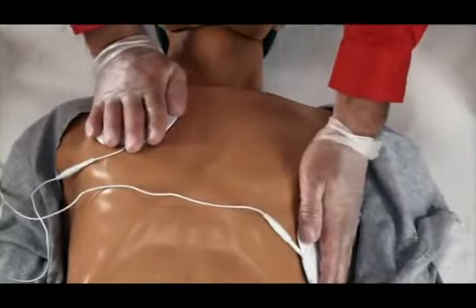If instructed by the AED, clear the victim and analyze the rhythm.